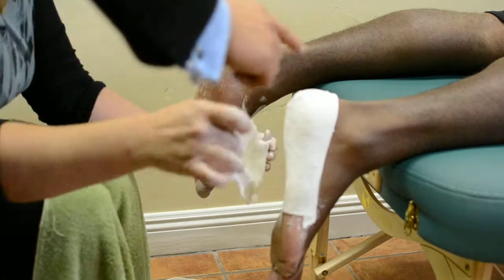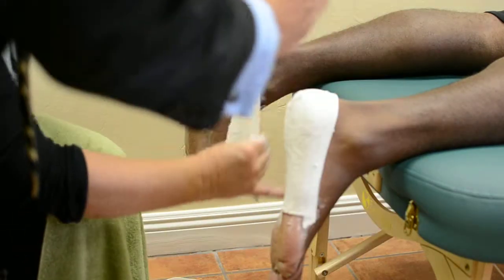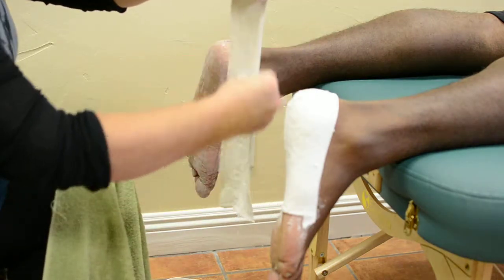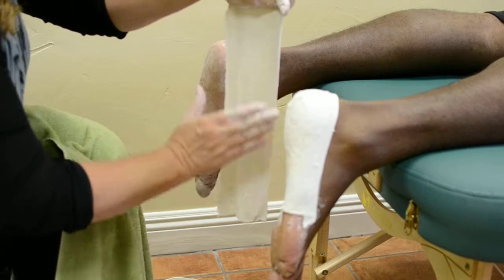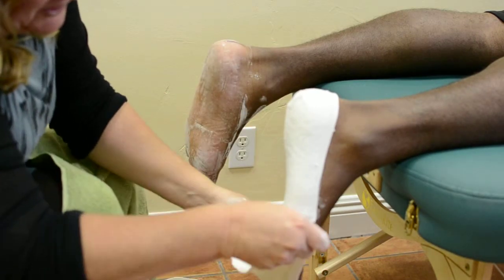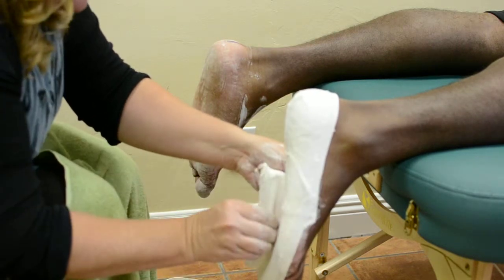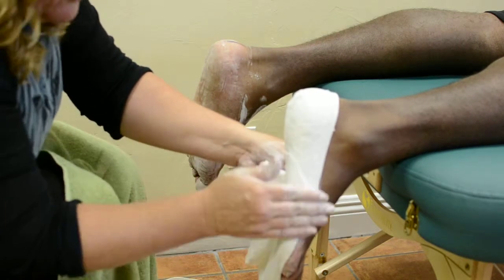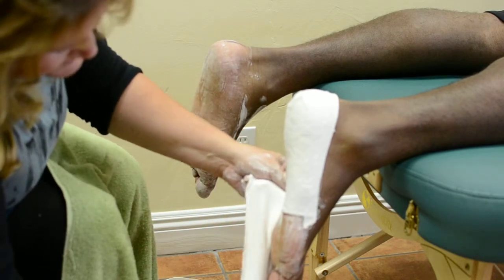What's the official name? Do they call this a heel strap, and this is the forefoot strap or stirrup or something? You can call it that if you'd like. I don't think we call it anything. Actually, when my boss teaches it, he has them do the forefoot first, which I just feel like, well, the heel's so much easier because gravity holds it down for me, and then I have something to attach the forefoot piece to. But do other companies cast?